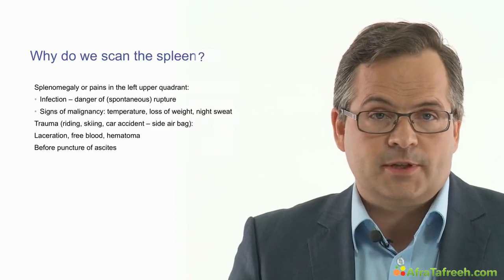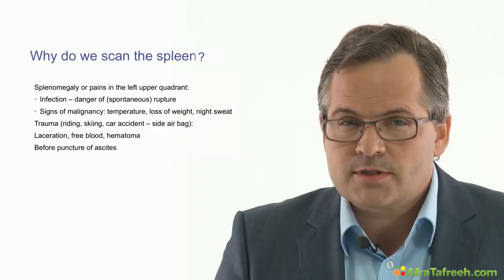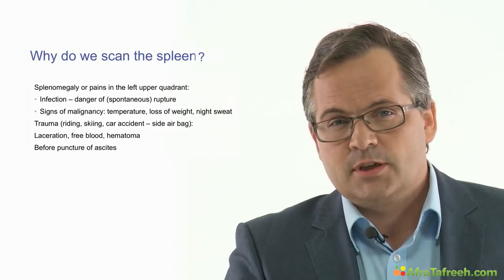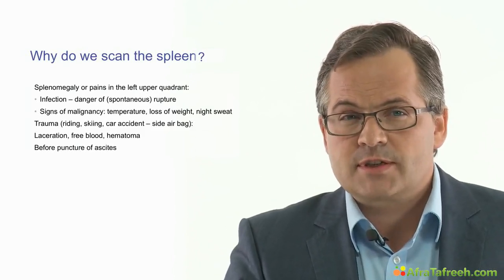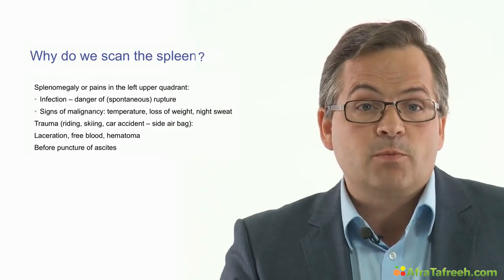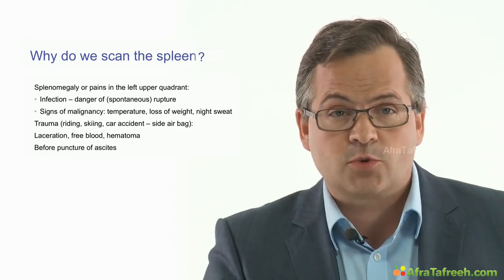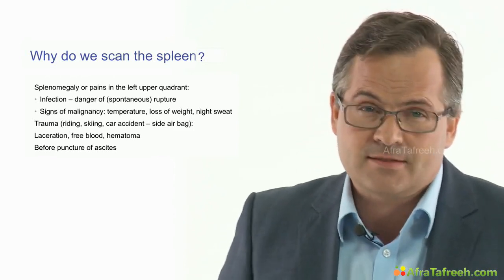Why do we scan the spleen? There are some quite good reasons for that. In the case of injuries, especially to the left side of the body, it may be life-saving to recognize the laceration in time. Only in this way will it be possible to save the patient's life by means of an emergency operation and to prevent the patient bleeding to death.